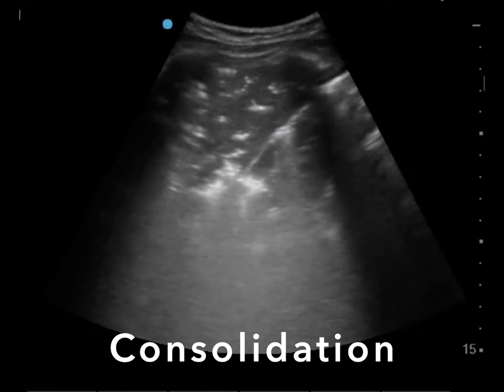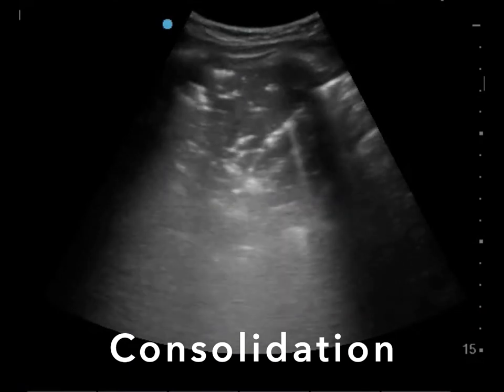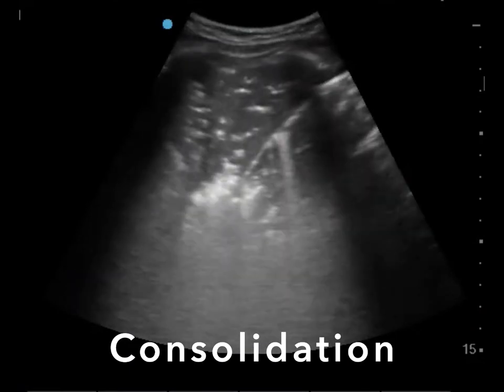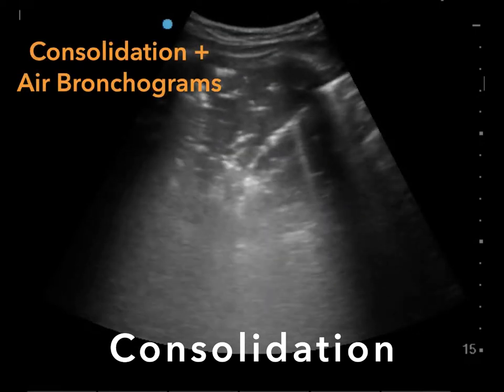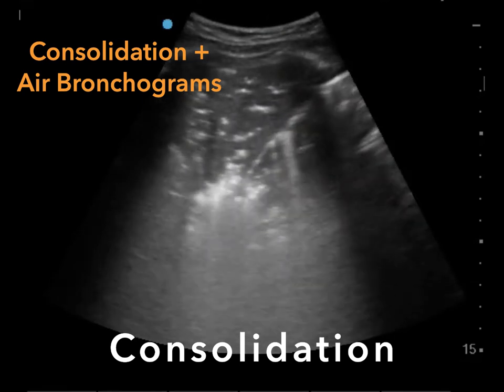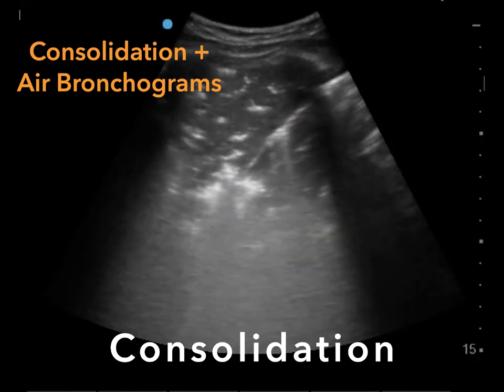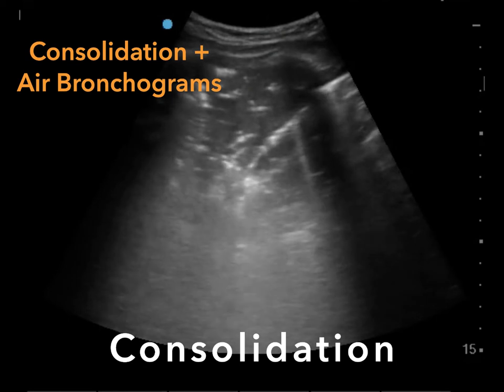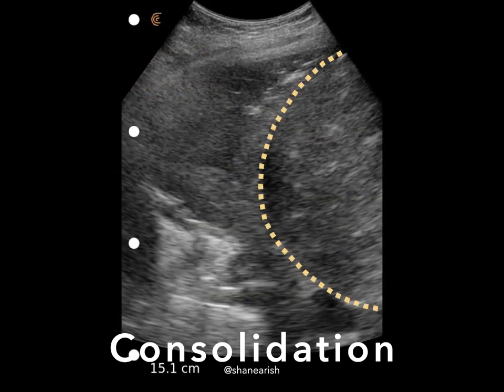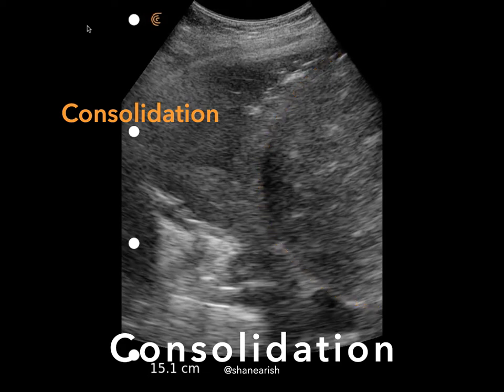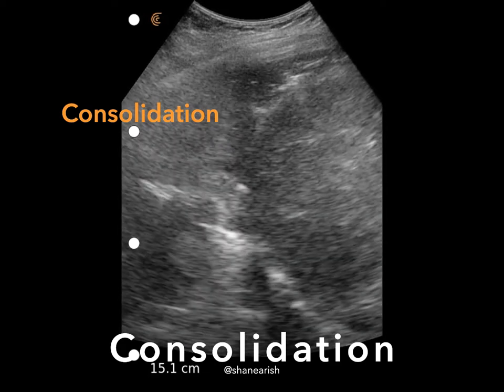When alveoli fill with fluid or are collapsed, you may see frank consolidation on lung ultrasound. It will result in a tissue-like density within the lung, and bright white areas within that density are air bronchograms — suggestive of pneumonia more so than atelectasis. Here's another example: the tissue-like density above the diaphragm looks like the liver. This is called hepatization — we know it's not the liver because it's above the diaphragm.